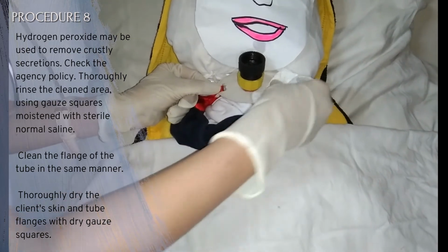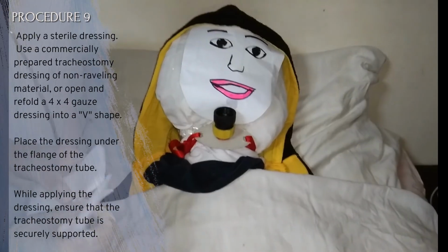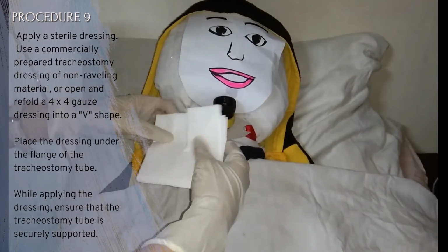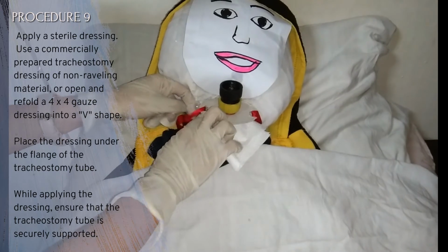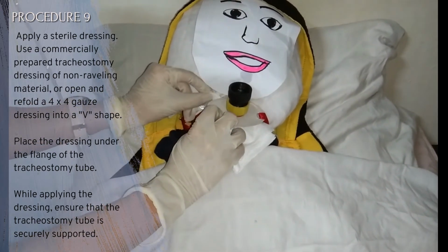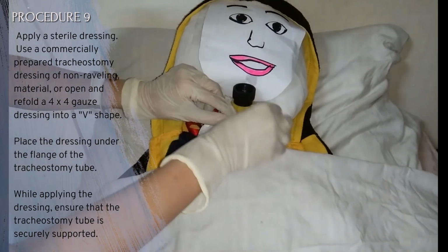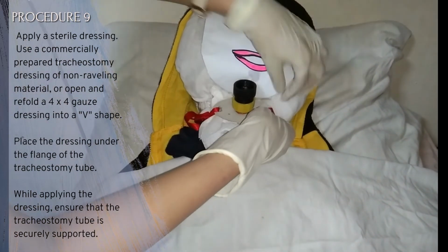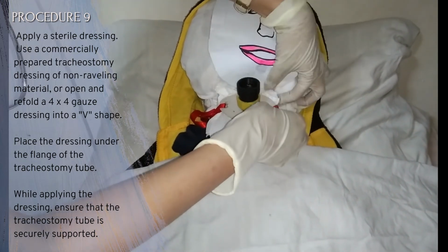Thoroughly dry the client's skin and tube flanges with dry gauze squares. Moist surfaces support growth of microorganisms and skin excoriation. Apply a sterile dressing. Use a commercially prepared tracheostomy dressing of a non-raveling material, or open and refold a 4x4 gauze dressing into a V shape. Cotton lint or gauze fibers can be aspirated by the client, potentially creating a tracheal abscess.